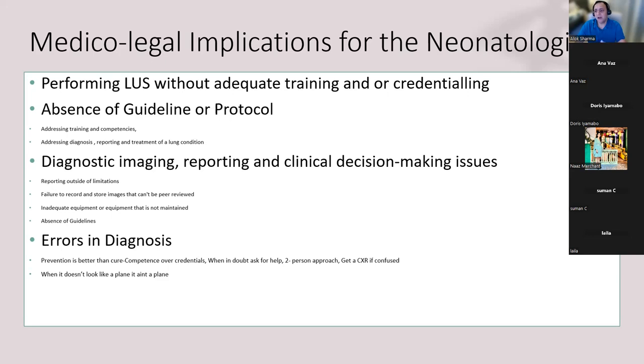While you're learning, you're clinically correlating, you're learning to interpret those images within the limitations of the scans you're performing with those machines, understanding the limitations of the machines, and making those diagnostic considerations. But where you're unsure, you're asking for help. If you don't have help and you are making decisions, then you are making them based on the clinical situation, the absence of further help, and in the child's best interests, in the best of faith. So you're doing this with your technical expertise, with the knowledge that sometimes we get these things wrong. What is important is that you are asking for trouble if you are working outside your limitations.